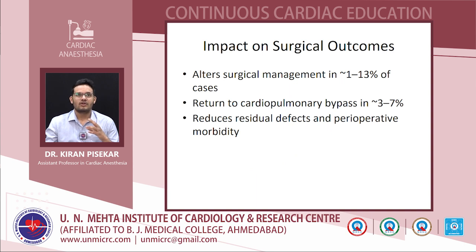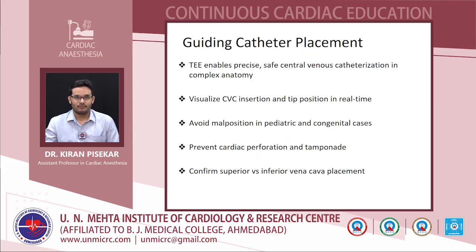Now, impact on surgical outcomes. It alters the surgical management in 1 to 13% of cases, and return to cardiopulmonary bypass in 3 to 7% of cases, and it helps in reducing perioperative morbidity. It also helps in guiding catheter placement. TEE enables precise, safe central venous catheterization in complex anatomy, visualizing the central venous catheter insertion and tip position in real time, avoiding malposition in pediatric congenital cases, and preventing cardiac perforation.